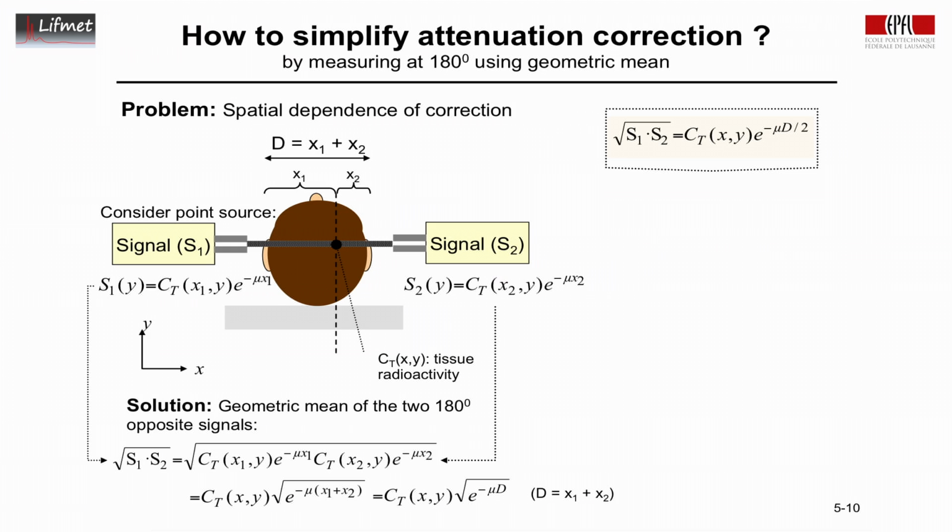So this now means that if we collect our signal this way from our subject, we no longer have to be concerned about where exactly in the body the X-ray is emitted, but we only have to consider the total travel distance of the X-ray through the object, along the left and the right. This correction works in this example for a pointwise source.